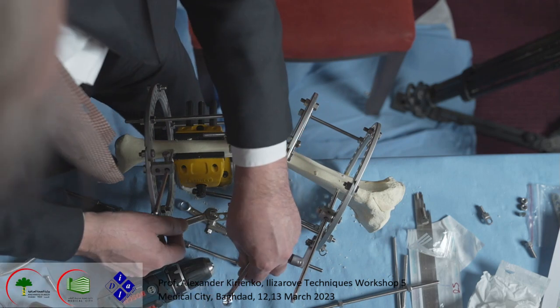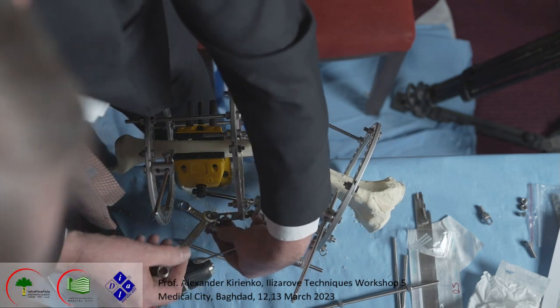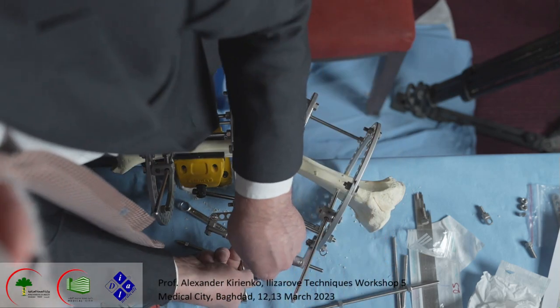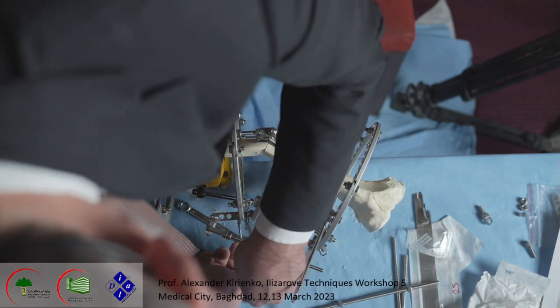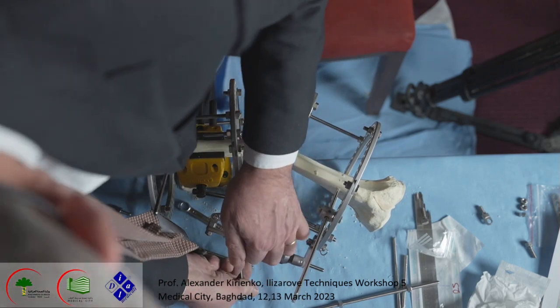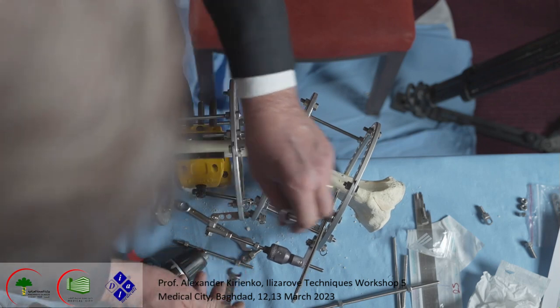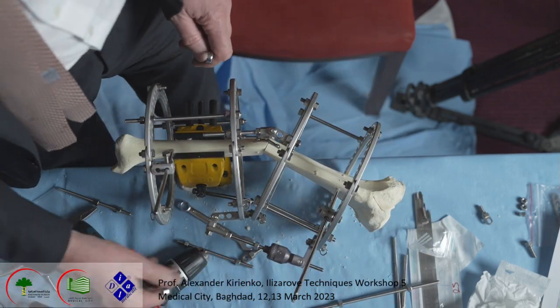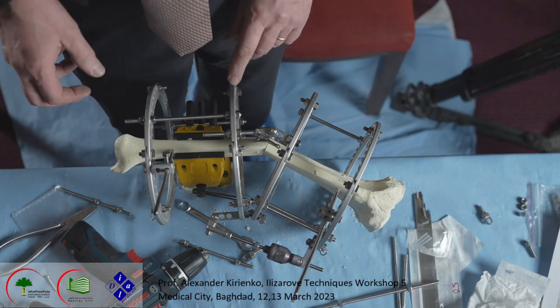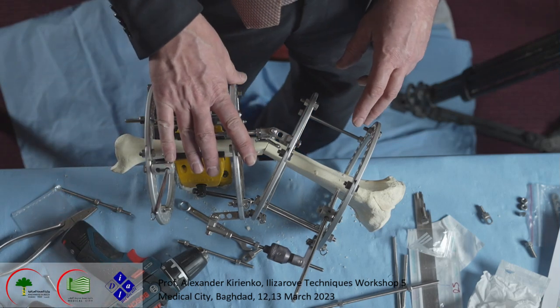And this is our motor. Comfortable for the patient. Tight here. This the patient uses, but we start to use it after the osteotomy. This is one system for correction.